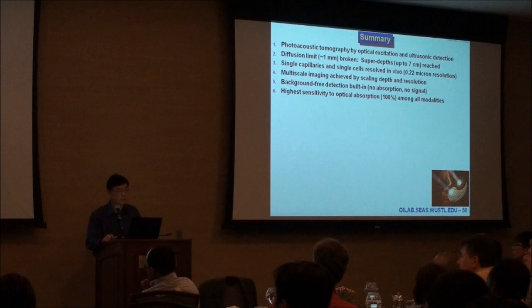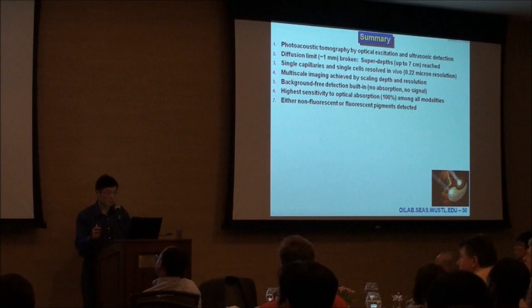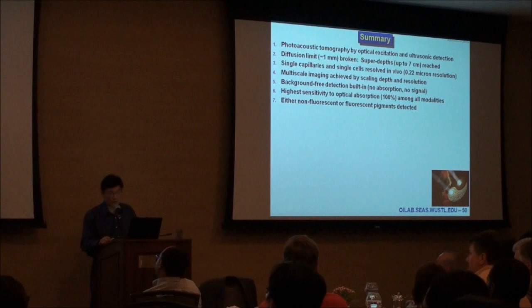In fact, if you compare this with OCT, photoacoustics is 250 times more sensitive to absorption. Of course, OCT is more sensitive in scattering, so the two technologies are highly complementary. Either non-fluorescent or fluorescent pigments can be detected. So basically, any molecules that are absorbing. It's a matter of finding the right wavelength.